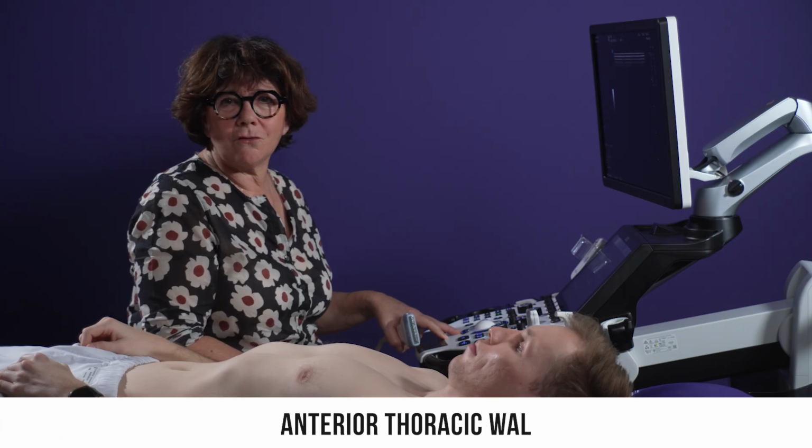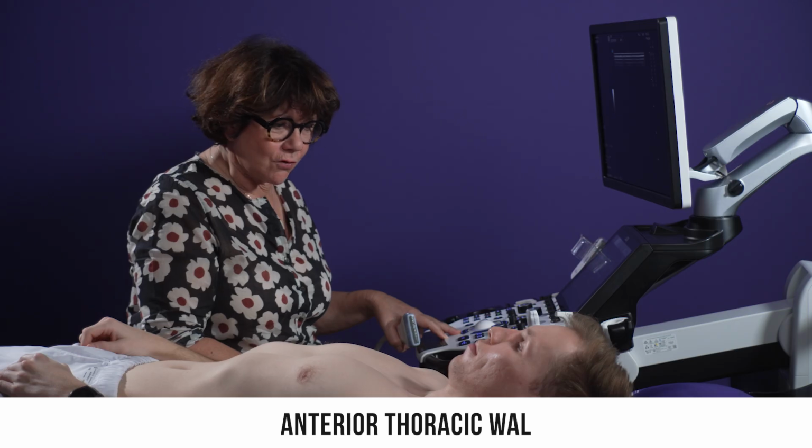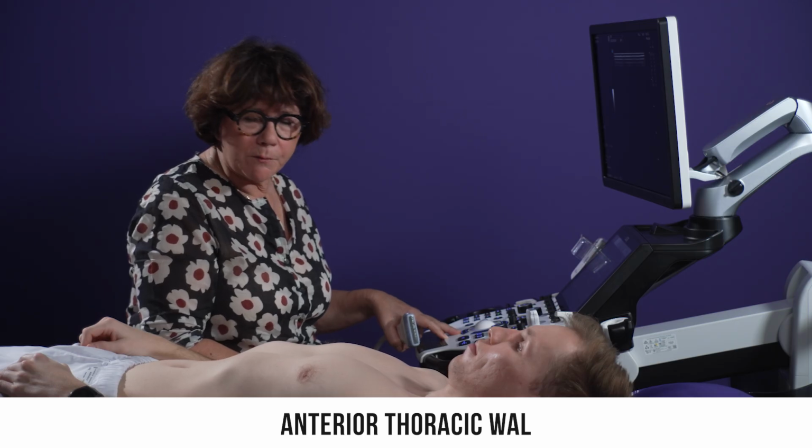Now let's begin the practical ultrasound exploration, starting with the anterior thoracic wall.